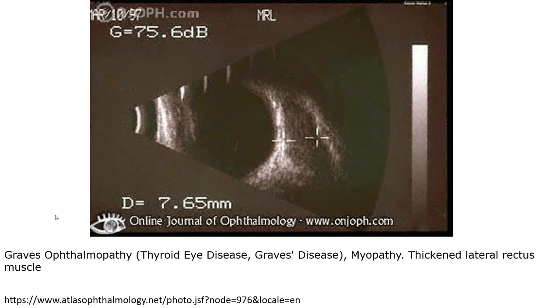This is what we call Graves ophthalmopathy, where the ultrasound shows a thickened lateral rectus muscle.